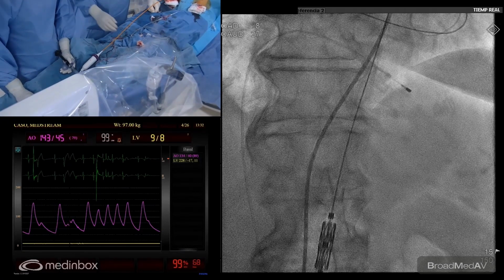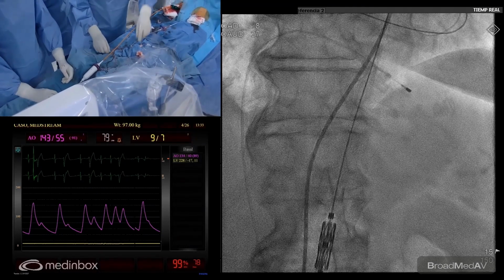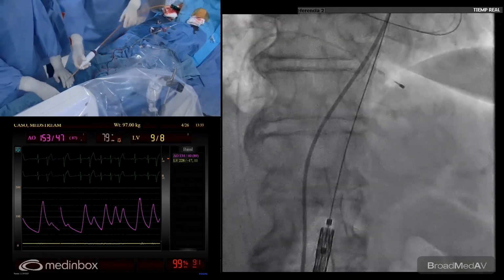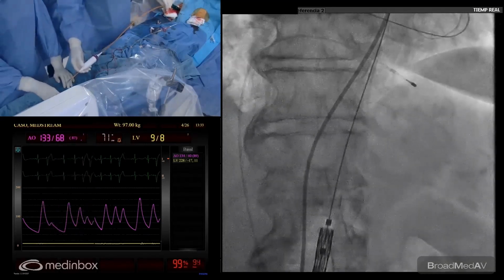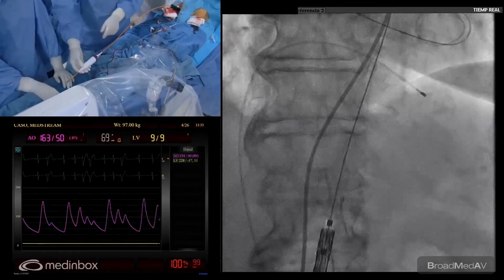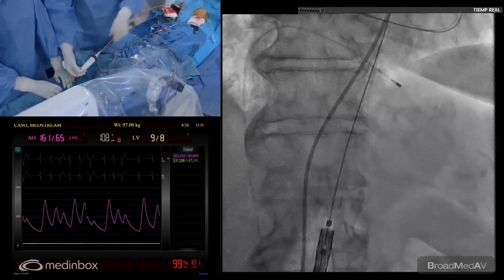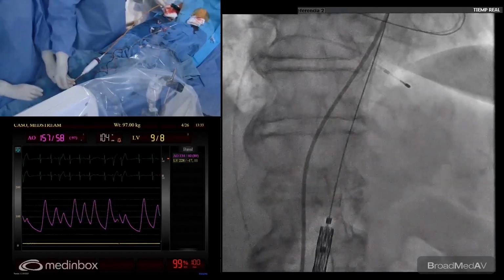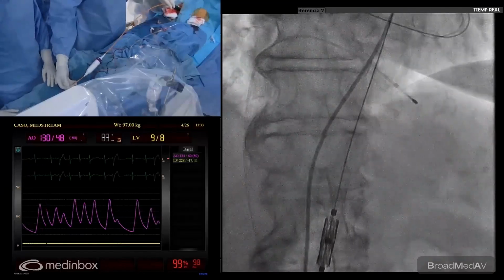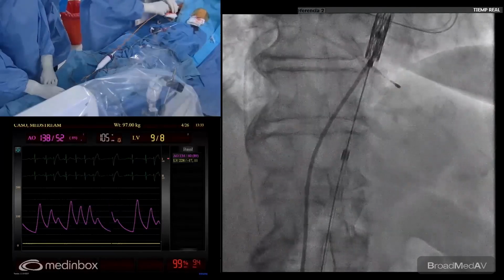Great. So probably we can describe something here. First, we don't have to load the valve as we had to do with the other balloon expandable valve. And also the sheath is a deflectable sheath in the same way. Is that correct? Exactly. And do we have to pull here or something like this before delivering the valve, or no? No, we only have to advance. Okay. And before crossing the arch, we have to deflect.